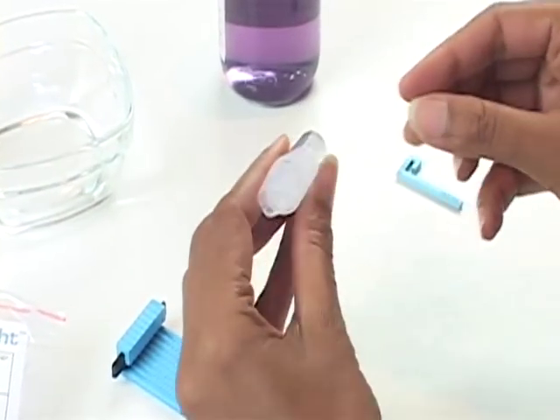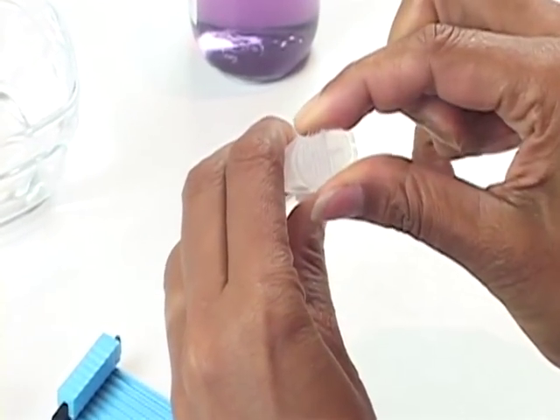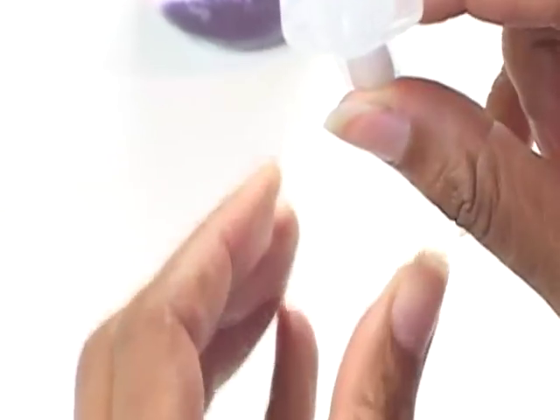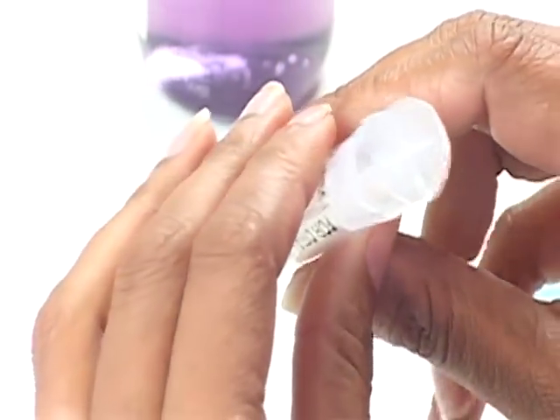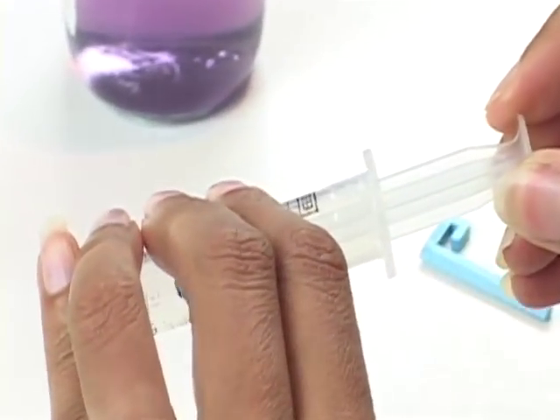Now take the oral syringe. Turn the piston such that the cross visible at the back is perpendicular to the finger flanges on the side of the barrel. Pull the piston back approximately half way.